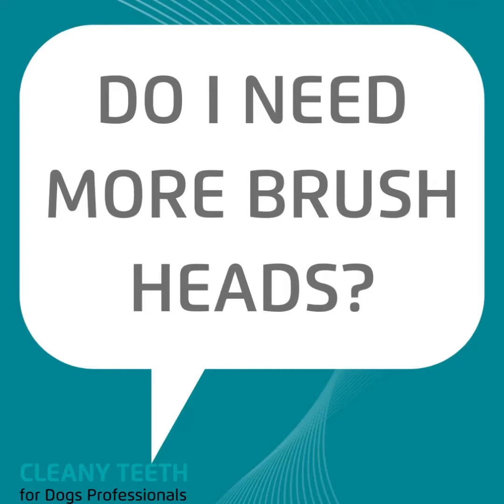Do I need more brush heads? We've already talked about how you don't need individual brush heads for each dog, and you don't need drawers full of brush heads just waiting to be used. You're going to need to replace brush heads at two points. The first is if those bristles start getting frayed — this can happen over time and use, but also if a dog has chewed or bitten down on the brush head. Try to prevent that, as it keeps your brush heads lasting longer.